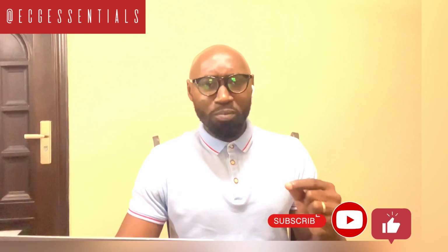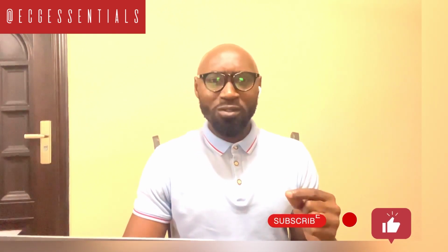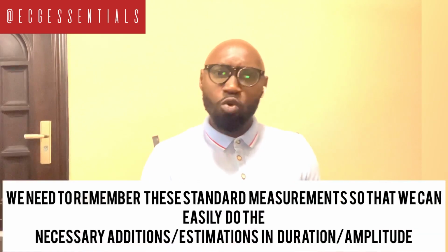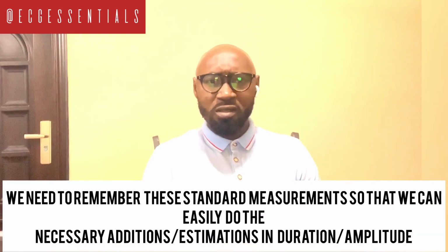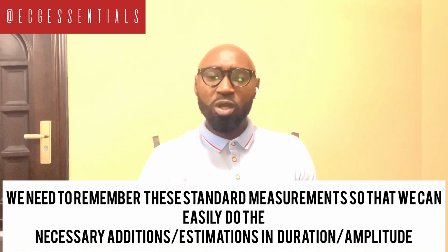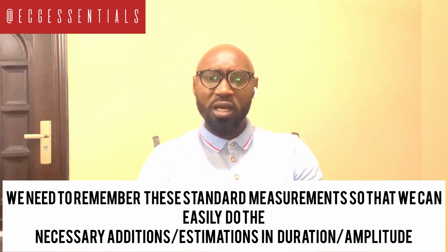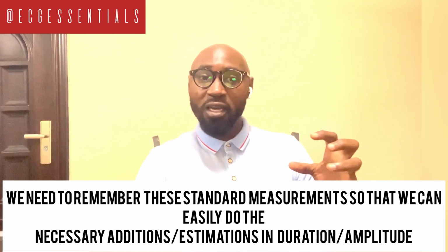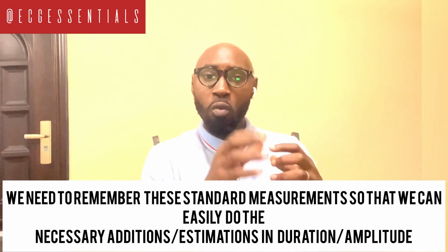So it's important for us to have these values off the top of our heads, so that we'll be able to do some of these required additions and estimations that we rely on to make our diagnosis. Of course, that is in addition to the information that we get from the form or the appearance of the waves.